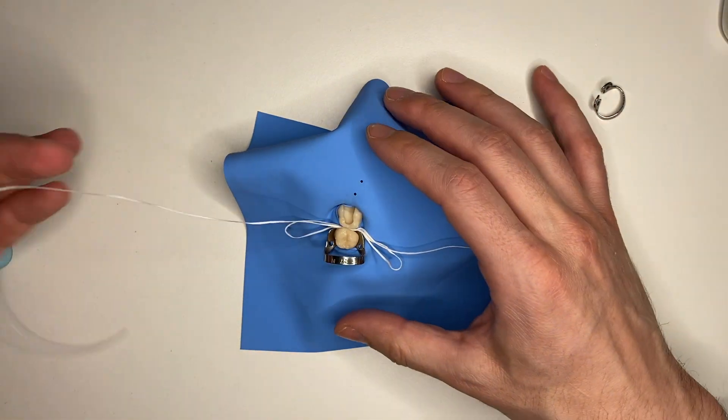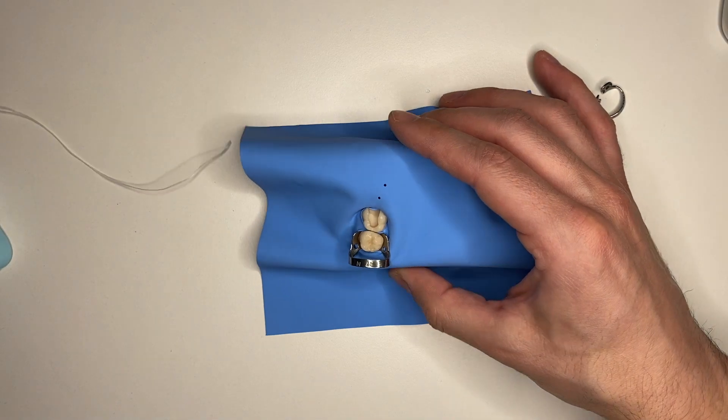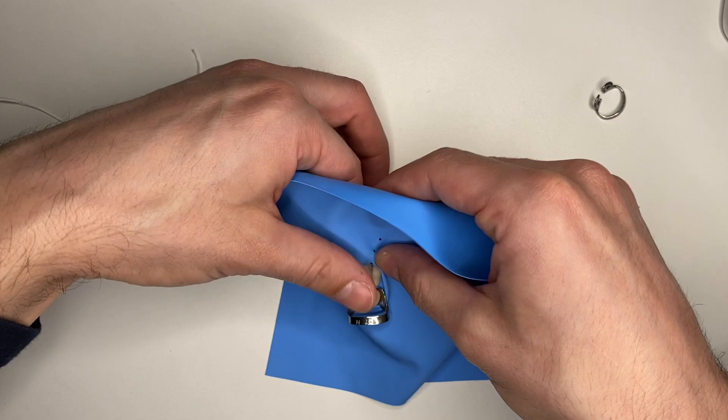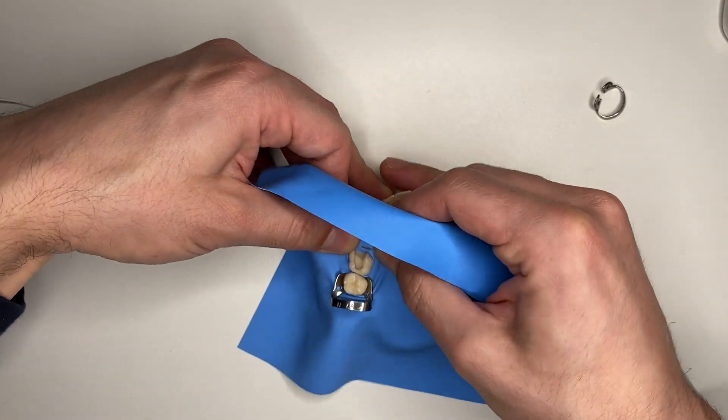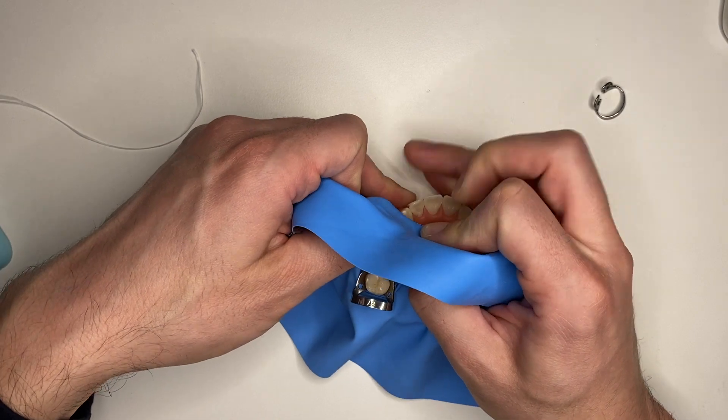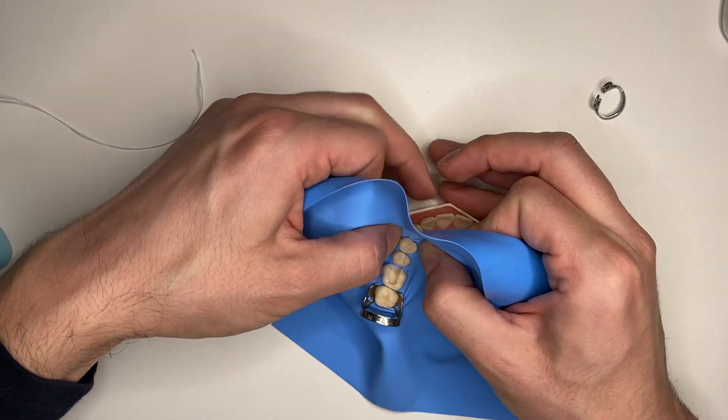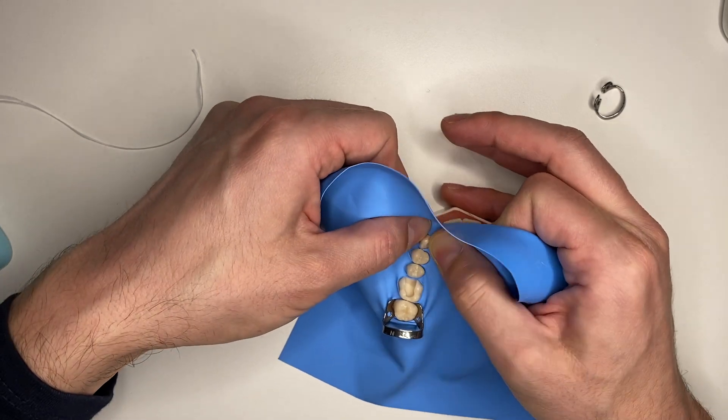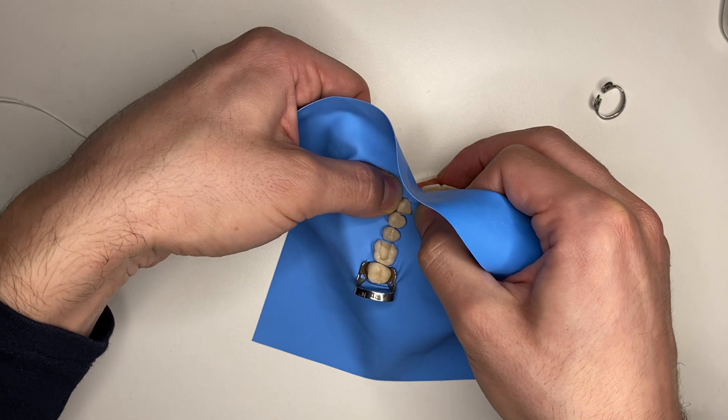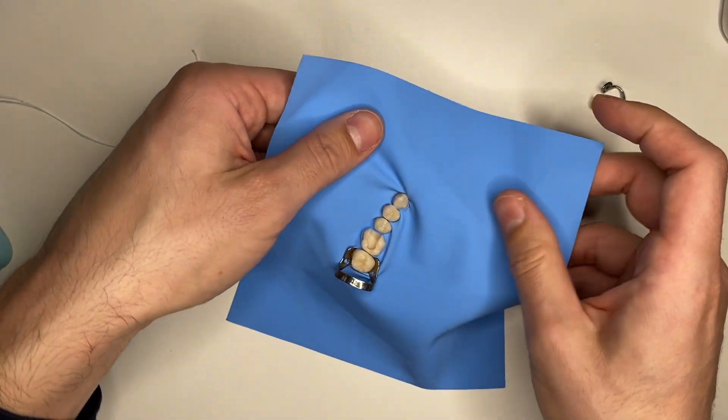By pulling one side, it's going to come out like this. It should be easy enough to go through the next space between the first molar and the premolar because I already have a prepared tooth. Then I'm going to go over the canine and just make a nice flossing motion at the canine so the rubber dam goes through completely.